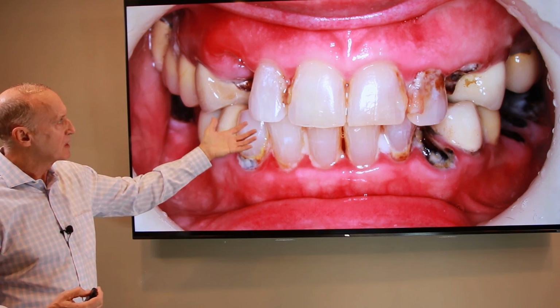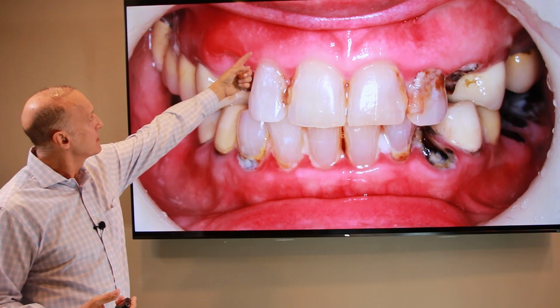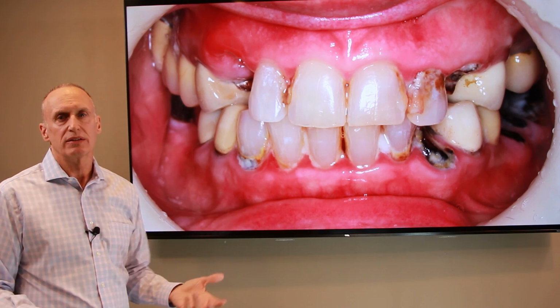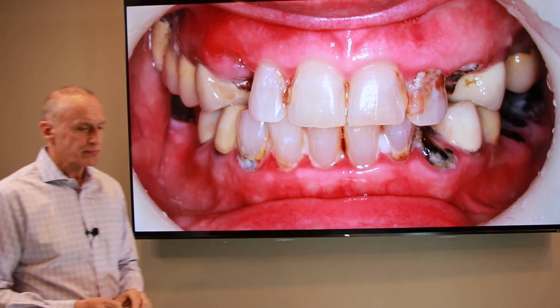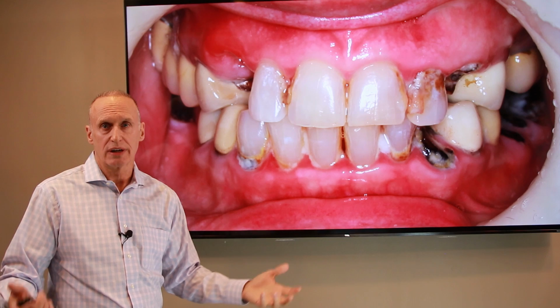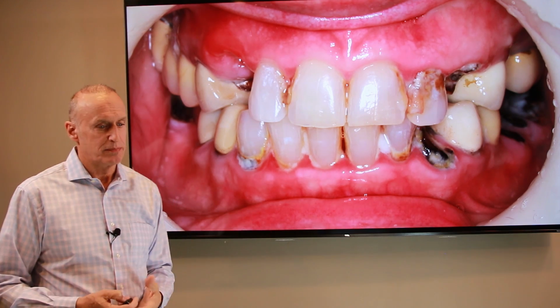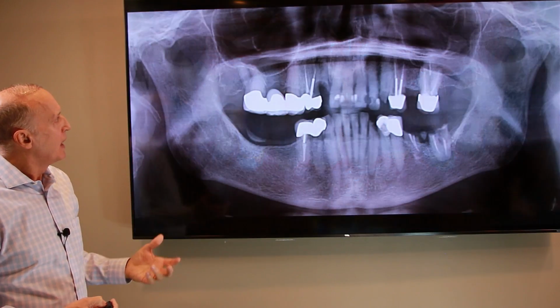So patients come in with a varying range of tooth problems. This lady has great bone and gum tissue, but she's got cavities everywhere. Literally all of her teeth are unsavable, non-salvable because of caries or dental decay. But her gums and her bone are good. So obviously if you take away a half an inch of bone, the patients are never going to have anything that looks or feels like teeth again. So our goal is to try to disturb that bone and the soft tissues as little as possible. So what I've come up with, and this is like the latest development in my protocol, as I'm trying to always make it better. Here's her x-ray.